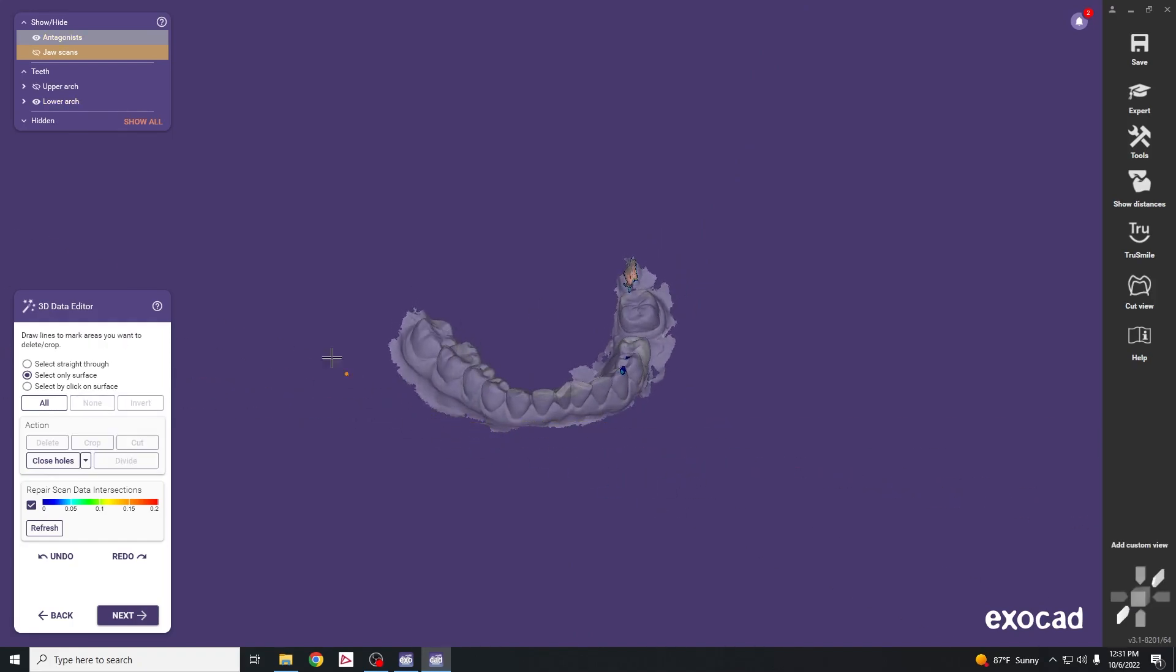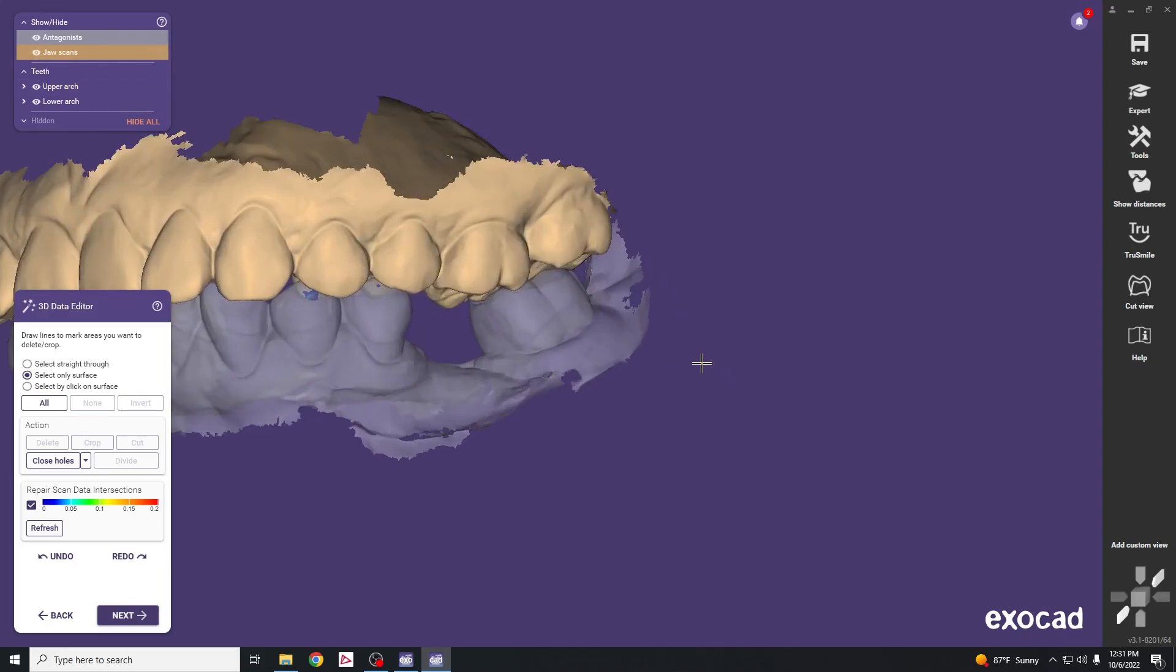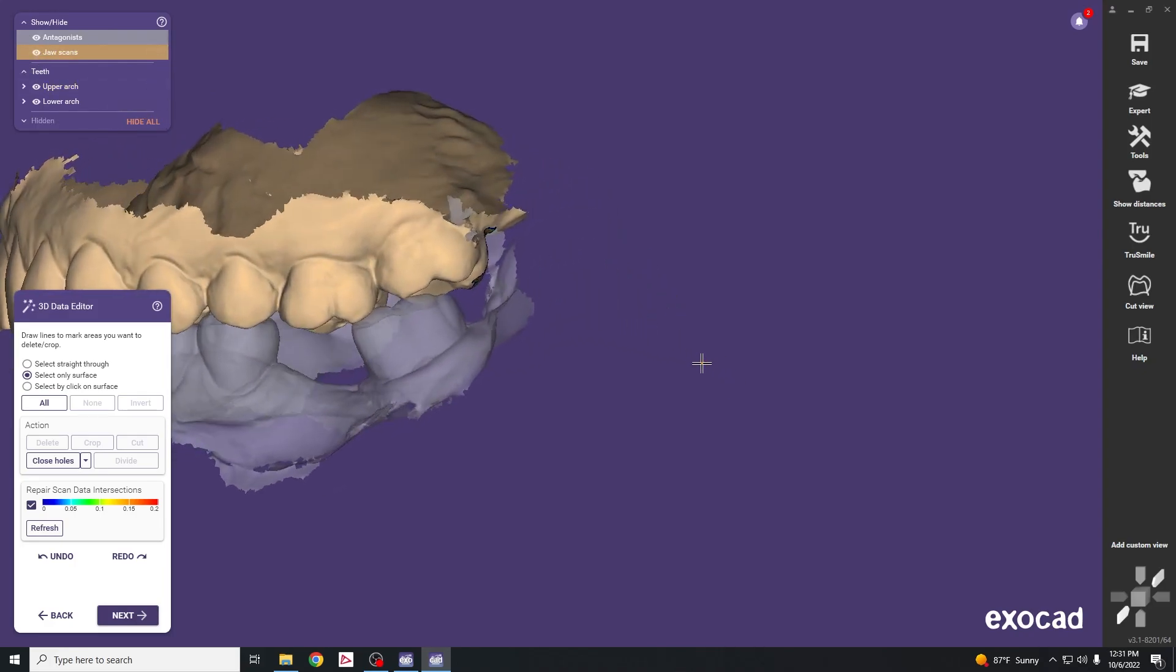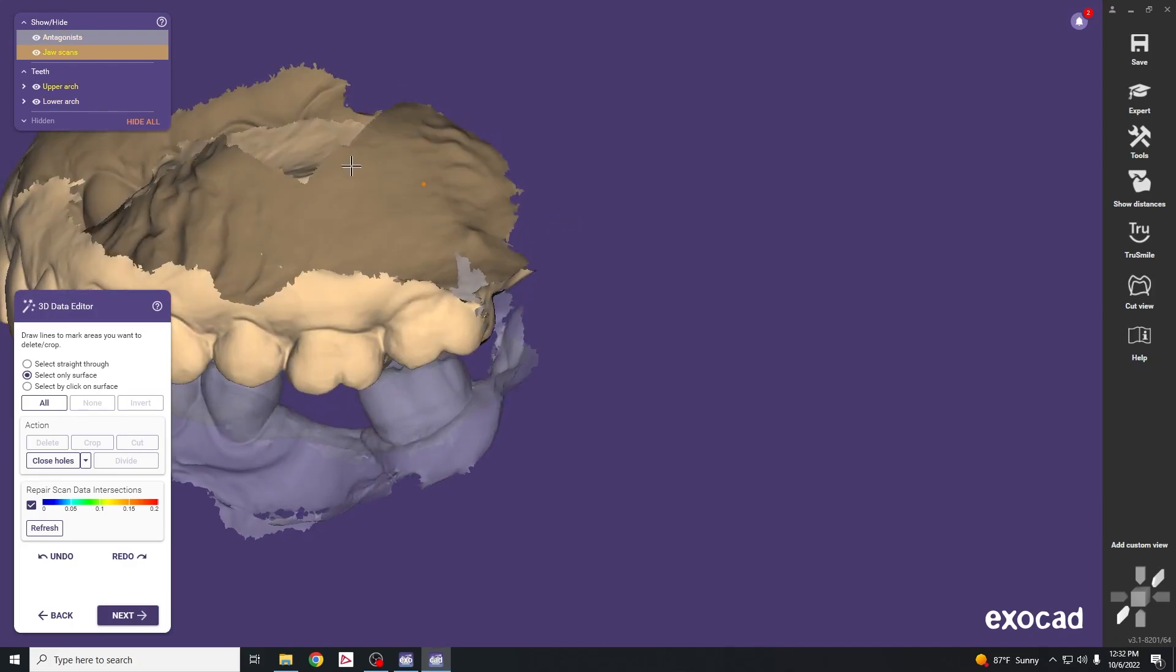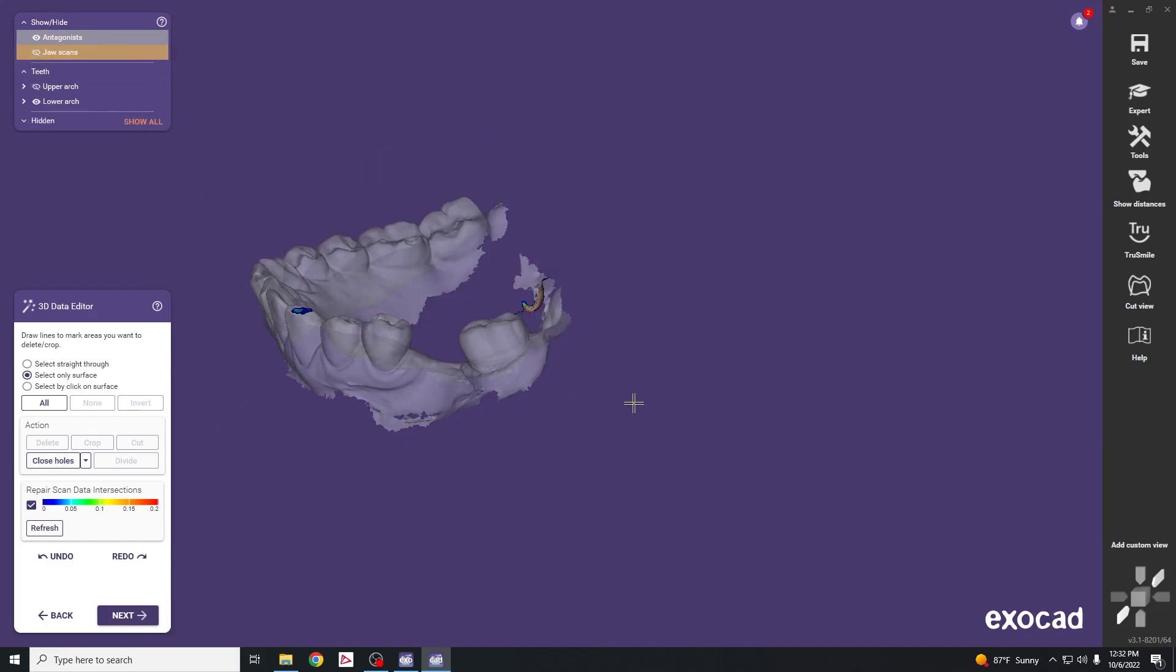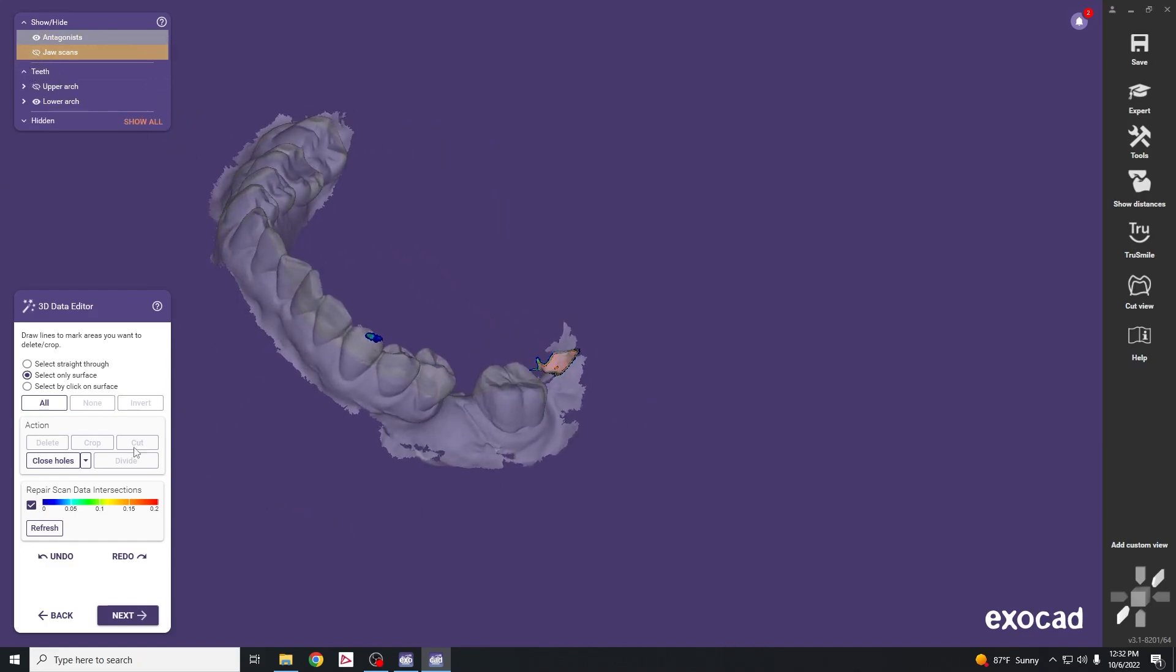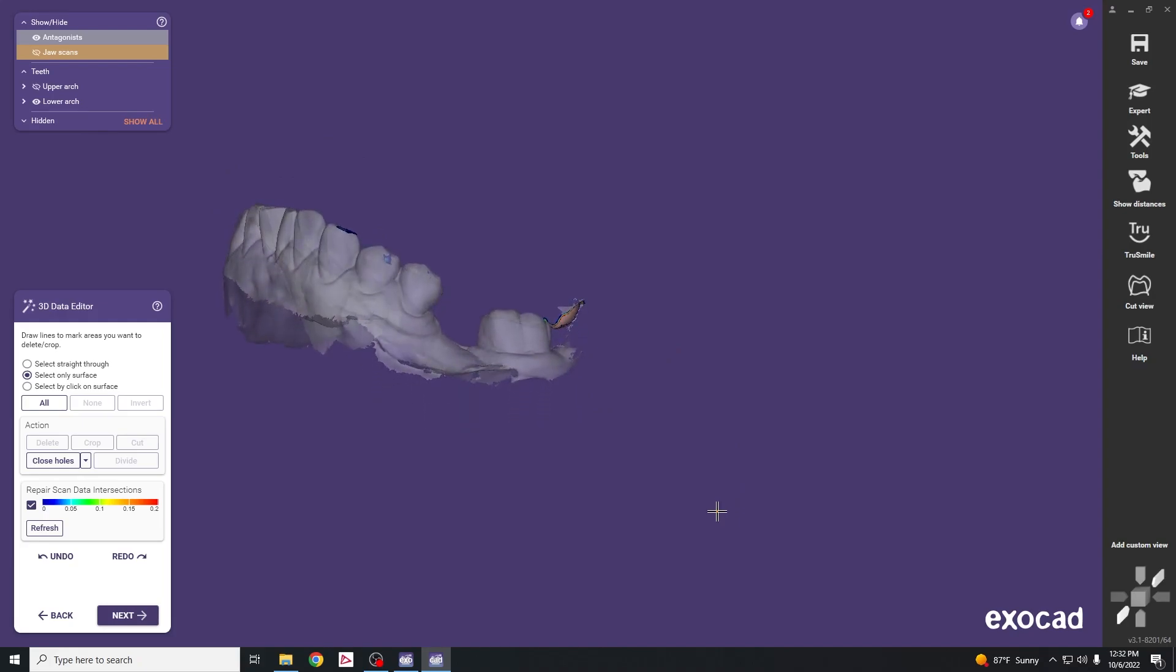Watch out for little remnants of the model left over. These are areas where the teeth or two casts are touching each other. On the heel area we have extra data touching that we don't want to keep. Go back to select only, draw a circle around the heel area and delete that.